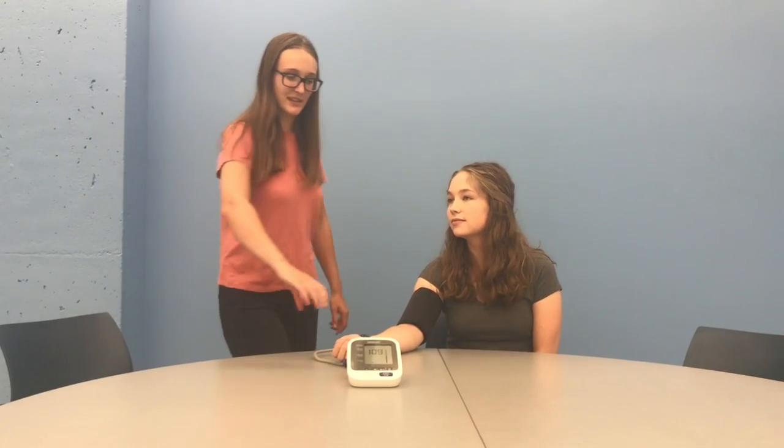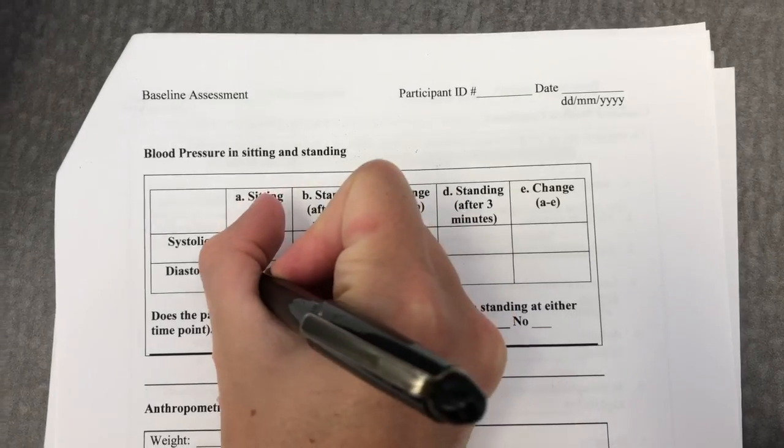Conversation should be limited, but if necessary, a brief explanation of the procedure can be repeated at this time. Once the seated blood pressure values have been recorded, keep the blood pressure cuff on the arm.